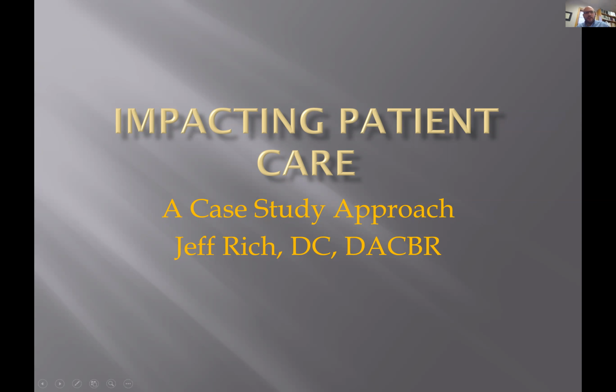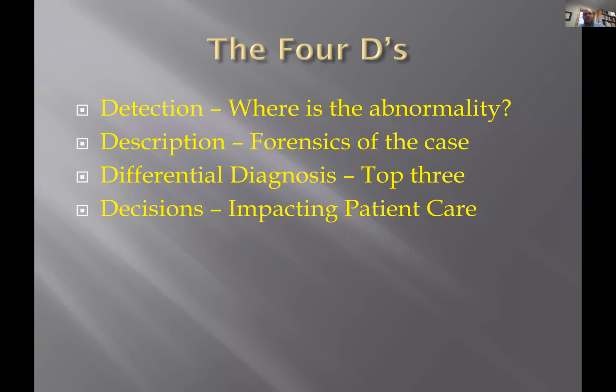All right. So to remind yourself, this is the flow. The 4 Ds are really how I'm teaching radiology now at Northwestern. It just represents how you approach your cases every day. You start out with detection, and of course the biggest issue of all here is to define the abnormality. So I like to have a few cases here where you're just looking, and this is hands-on. This is you doing it. This is you practicing radiology, getting better at it, being reminded on the basics.